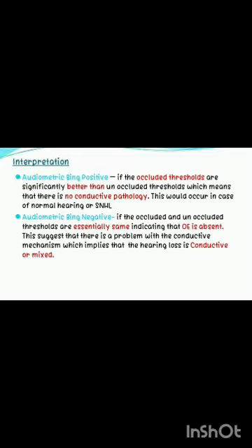Interpretation: audiometric Bing positive if the occluded thresholds are significantly better than unoccluded thresholds, which means that there is no conductive pathology. This would occur in case of normal hearing or sensorineural hearing loss.